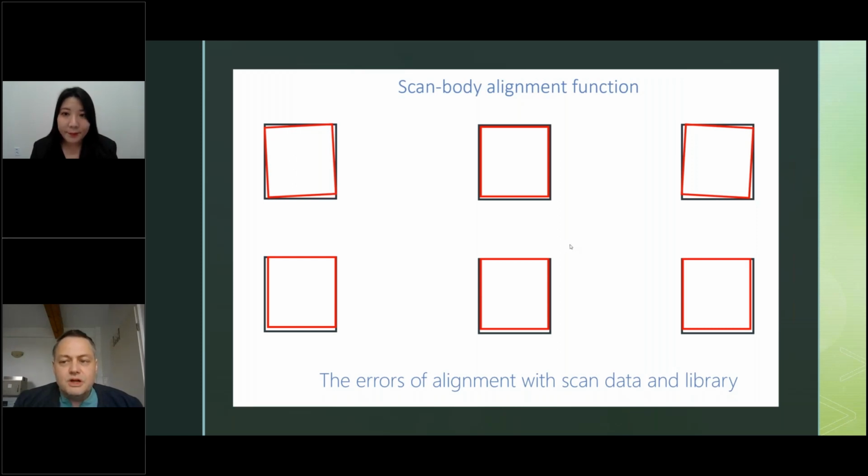So if you want a good scan body, you're going to buy it from your manufacturer or from a third-party manufacturer with industrial capabilities, so that the connection is perfectly milled and fits correctly in the implant.